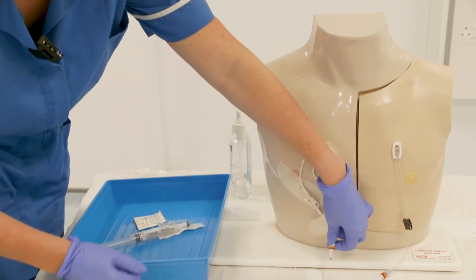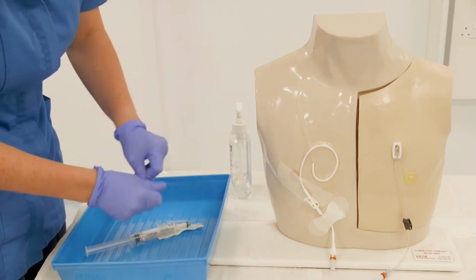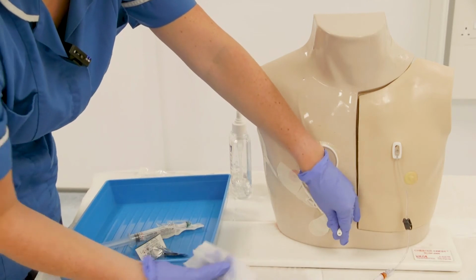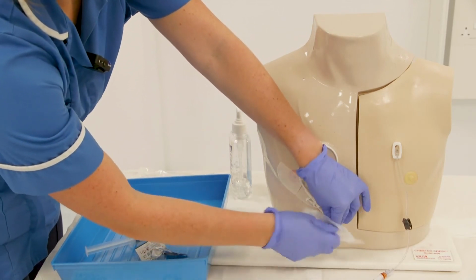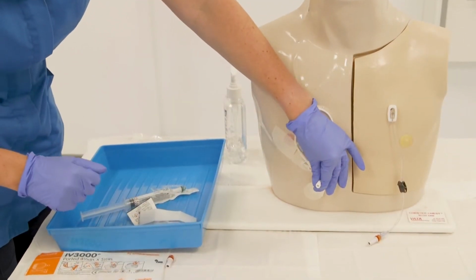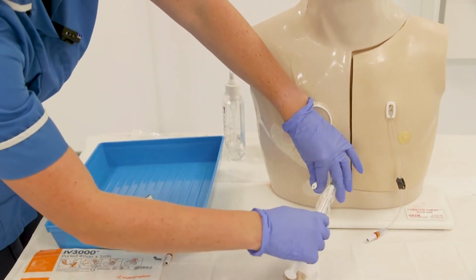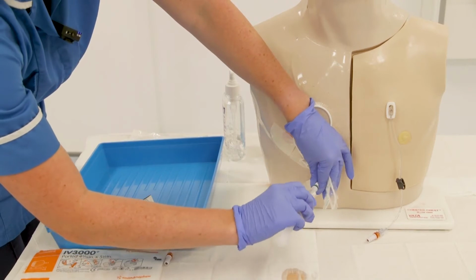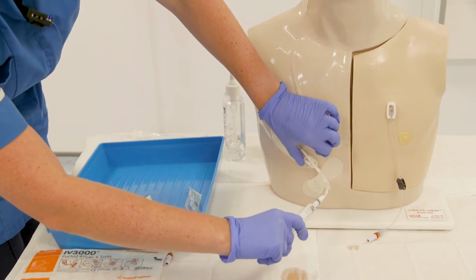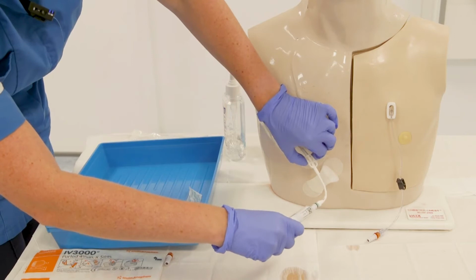The most important part when you're changing a bung is to check that the clamp is shut, and then you can take off the end of your bung. Take off your old bung and then clean the inside of it for 30 seconds. And then most importantly, also let it dry for 30 seconds. Once this has been done, you can then attach your new bung. Without touching the ends, screw on your bung and then flush your line. Using a push-pause technique, flush your line, and then with the final bit, clamp and push at the same time.